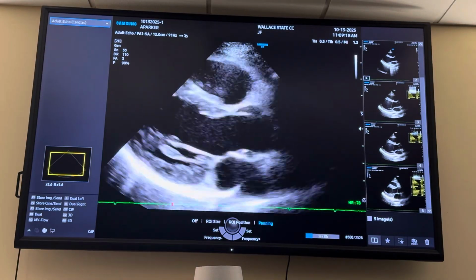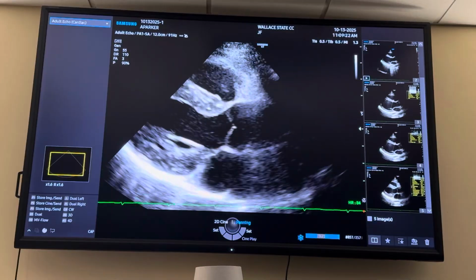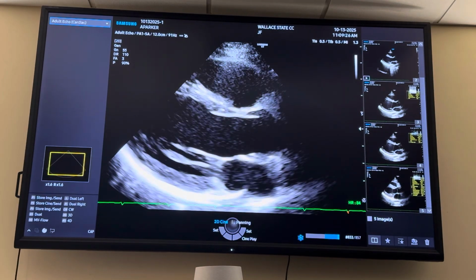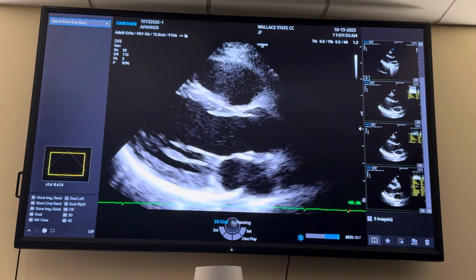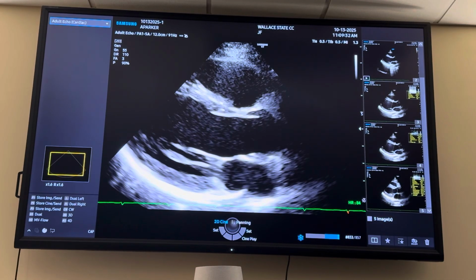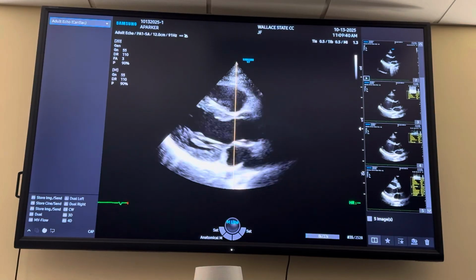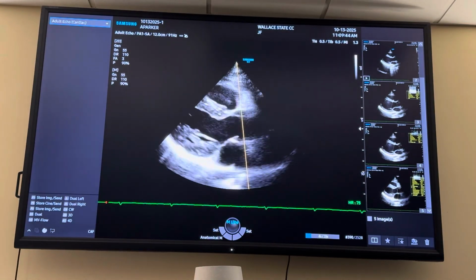So you just make sure you have your aortic valve, your LVOT, all that opening well. Because if you're measuring it and getting it too small, which is going to be hard to underestimate yours because you can see it so well, you should be close to 2. 1.92, that's pretty common, but if you're getting like 1.4, 1.5, you need to go back and try to remeasure it. Here we're also going to do M mode through each of the aortic, mitral, and the left ventricle.